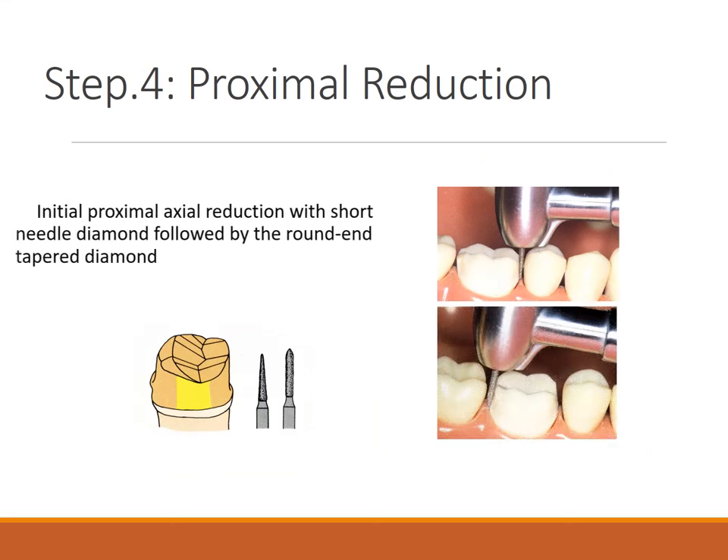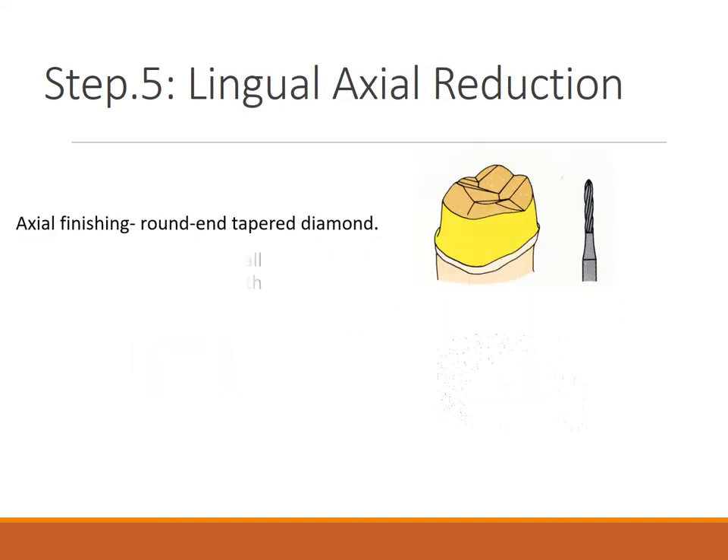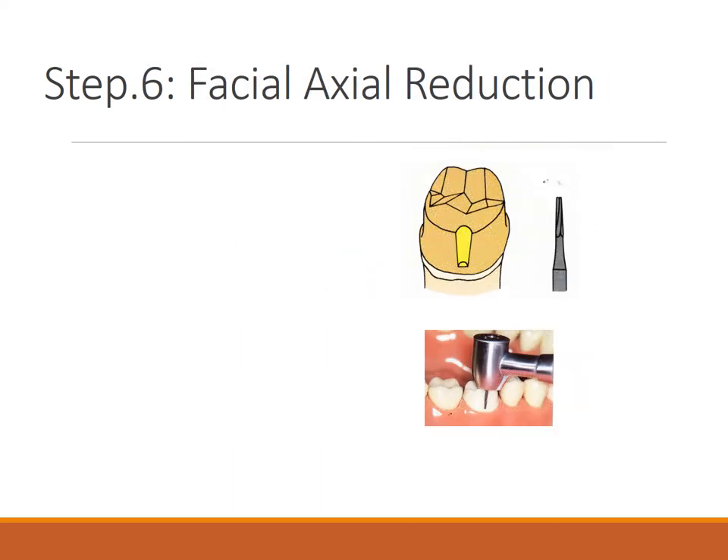Step four is initial proximal axial reduction using a short needle diamond followed by a round and tapered diamond. You follow the same principle as anterior — nick off from here, make a cut, and nick off from the instrument so you do not injure the adjacent teeth.